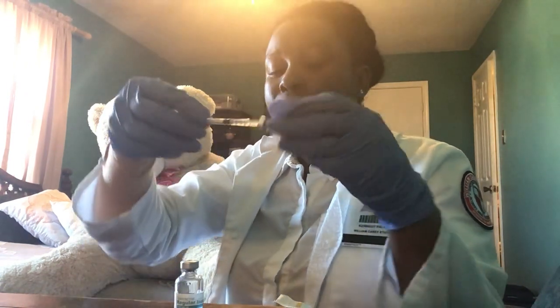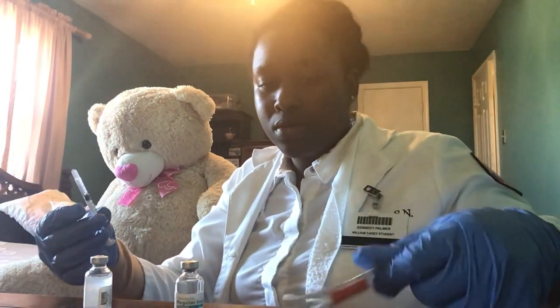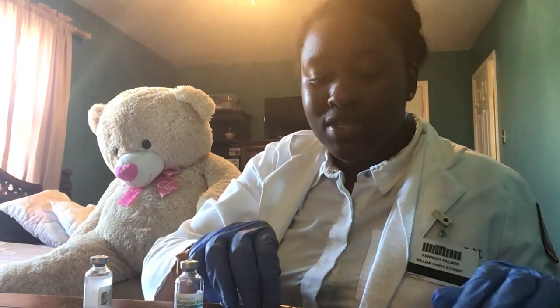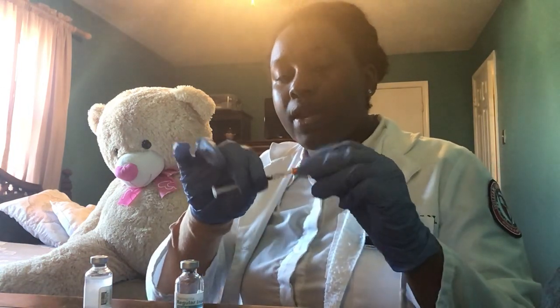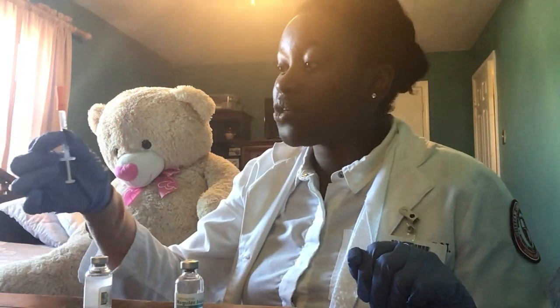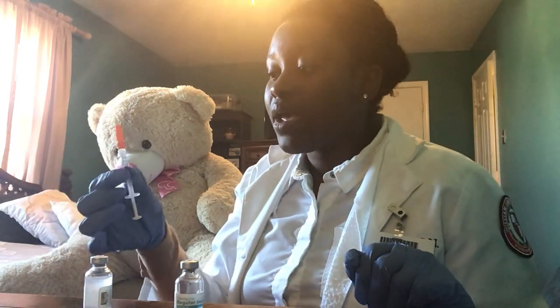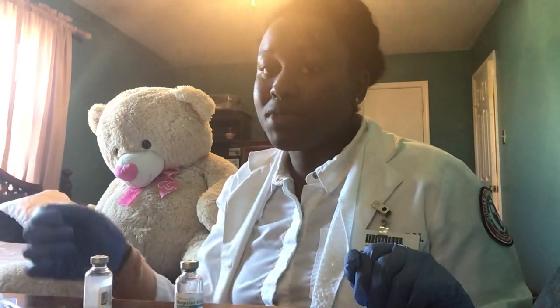Okay. I'm just going to place my needle back inside of its cap by doing a swoop technique. Okay, and I have my insulin here in my patient's room. Before I give my insulin, I'm just going to let another nurse check to make sure that I have the right medication and the right patient and the right route and right dosage and the right indication and documentation.